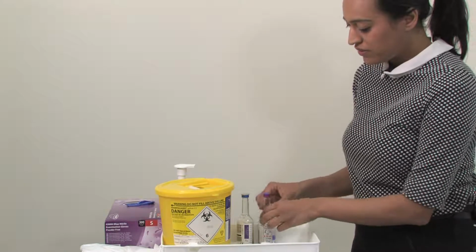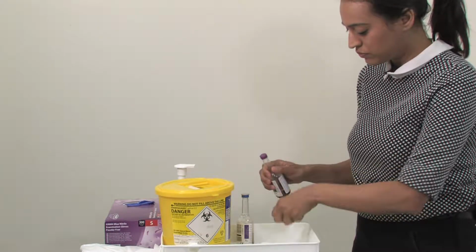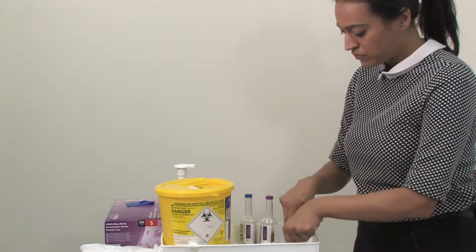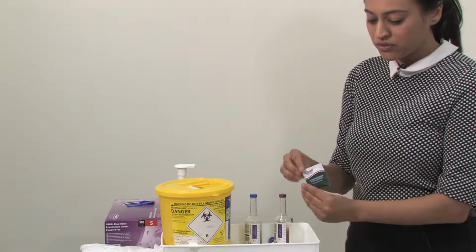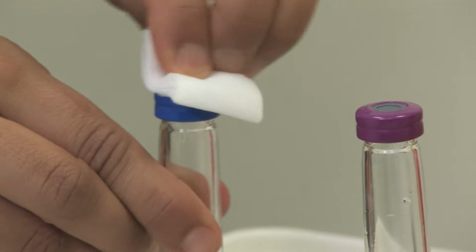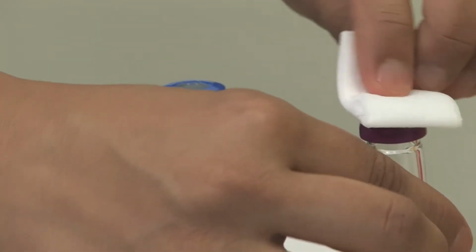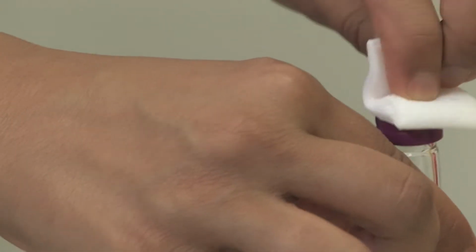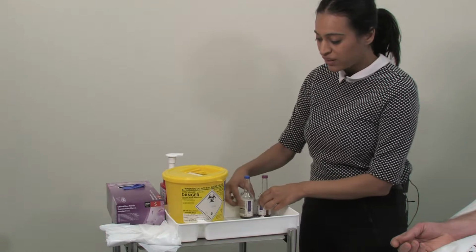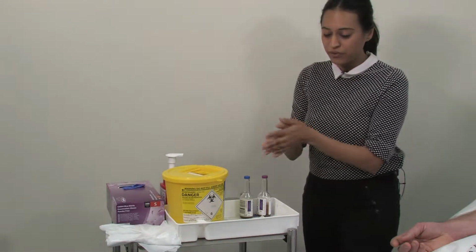The next step is to take the top of our blood culture bottles off and wipe them using the 2% chlorhexidine wipe. Whilst these are left to dry, we can now decontaminate our hands again and put some gloves and apron on.